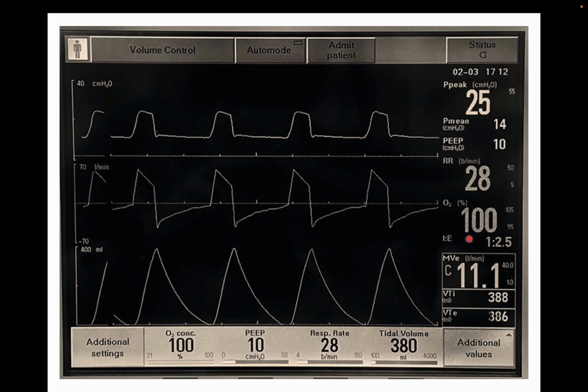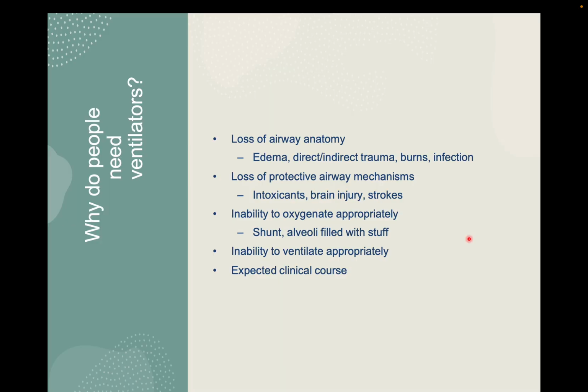So whatever volume is retained because of the insufficient expiration will generate a pressure inside the alveoli, that is called auto PEEP. So this is commonly seen in the case of inverse ventilation, where we increase the inspiration and decrease the expiration, or in COPD patients, because of the obstruction in the expiratory pathway, air can't be expired completely. So in them auto PEEP can be seen. We will discuss auto PEEP in the further slides.